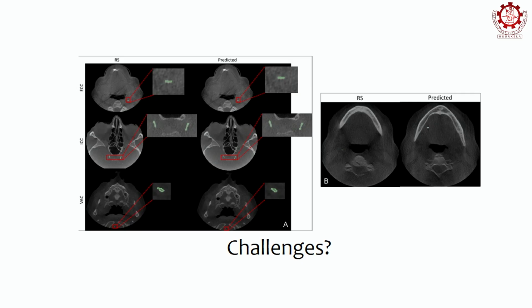Before I go to the results, you see the calcifications here, and we have different kinds of calcifications. These are the ground truth calcifications, and these are the predicted calcifications. So by looking at the calcifications, do you observe, or do you think there's any challenge that machine learning models might face here in order to identify these calcifications? What's different from this and what you have been seeing so far with other images, let's say vessel images or brain tumors?